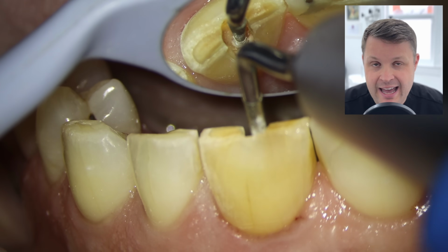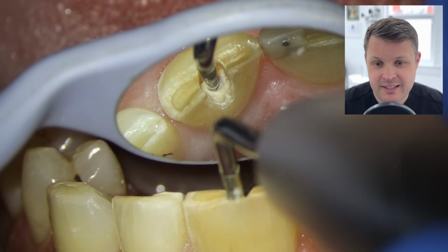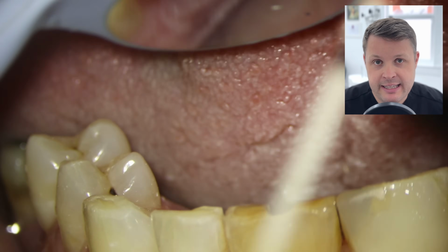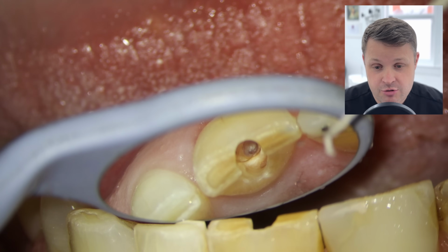But I've got to be really, really careful about orientation here. I'm really mindful that I am going a little bit off center. So we're just using really careful, diamond-tipped ultrasonics here, just to try and go essentially straight down the center of the tooth.